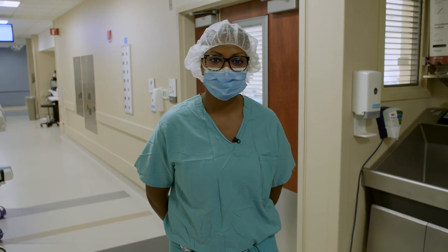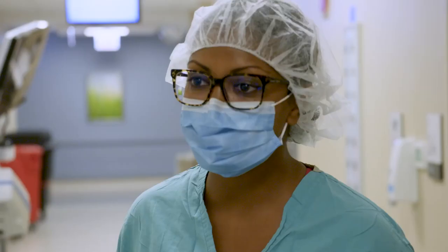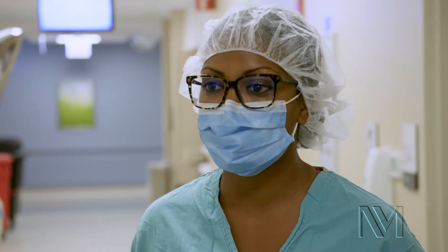Hi, my name is Linda Suleiman and I'm an orthopedic surgeon specializing in hip and knee replacements here at Northwestern Medicine. Today I'm going to take you inside the OR where I'll perform a robotic total knee replacement. Come with me.